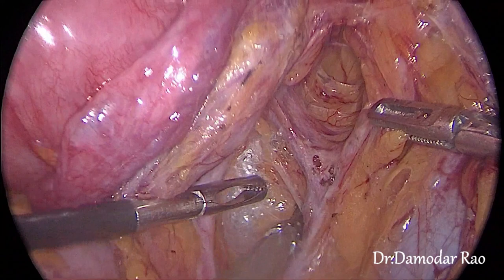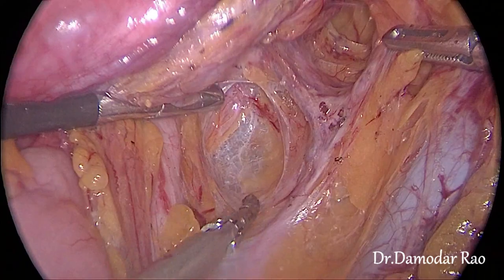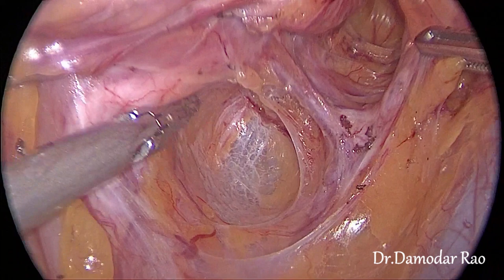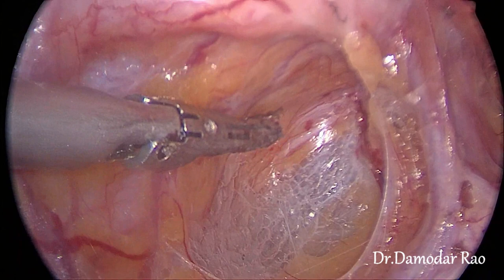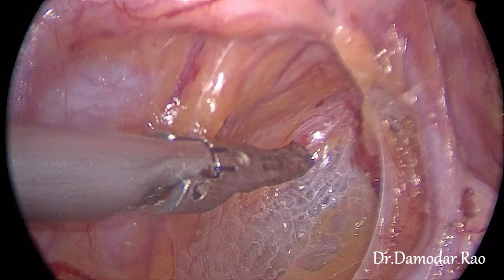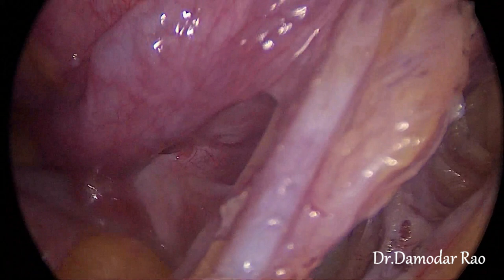The pararectal space is further divided into the medial and lateral pararectal space. Here I am going into the medial pararectal space where you can actually see the inferior hypogastric nerves. These nerves are very important in bowel and bladder function and are to be preserved in nerve-sparing radical hysterectomy or in cases of severe endometriosis. You can clearly see the nerves — the white structures are the nerves. This is exactly parallel to the rectum, and that is the rectum visible there.